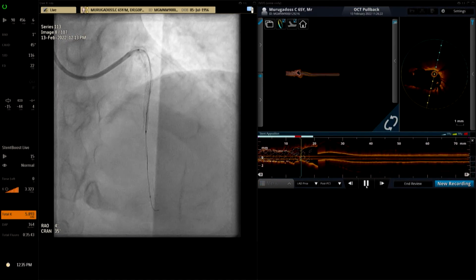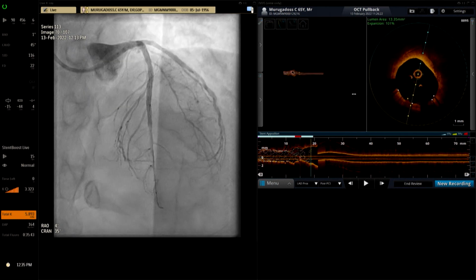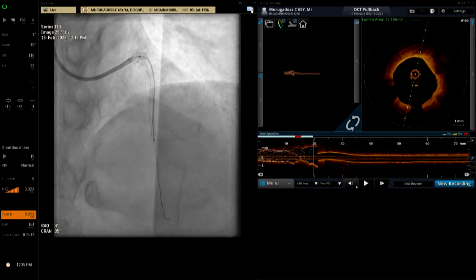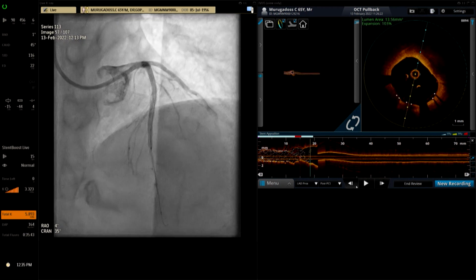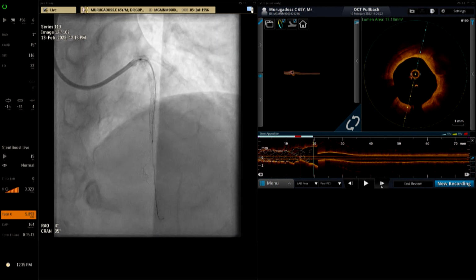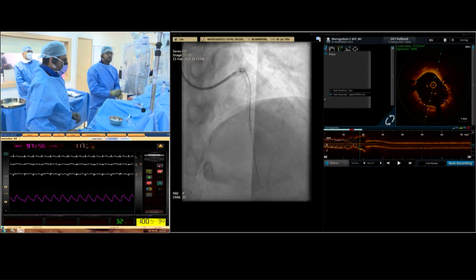Inflow. So there you can see we're just showing the inflow of the stent. Very small area of stent into the left main, but this is the stent inflow. You can see there, well opposed, and the rest of the left main into the aorta is pretty good, and I think we are done here. Nice final shots and images.